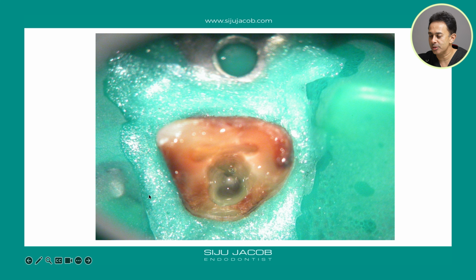So when we look at this tooth as a whole, what we are seeing is there's not much tooth structure left palatally compared to labially. There's a lot of tooth structure left when we look at this tooth from a labiopalatal direction. So if you continue to drill here, then that means you are playing around with very little tooth surface here. So the probability of finding a canal here is not great.